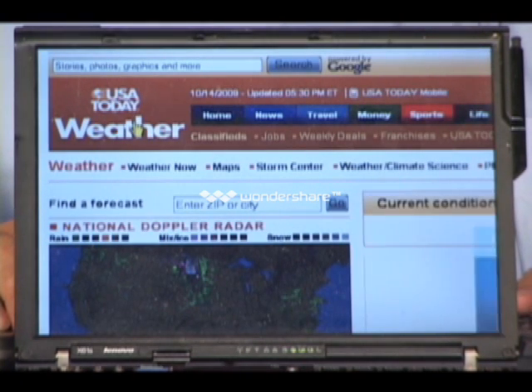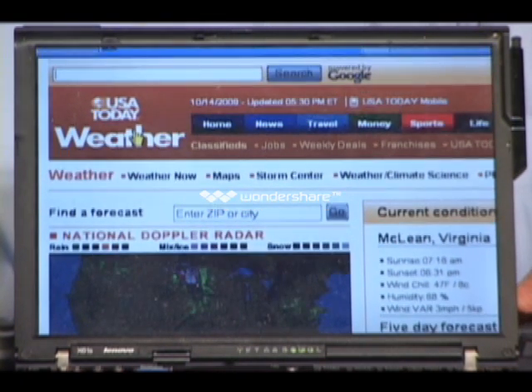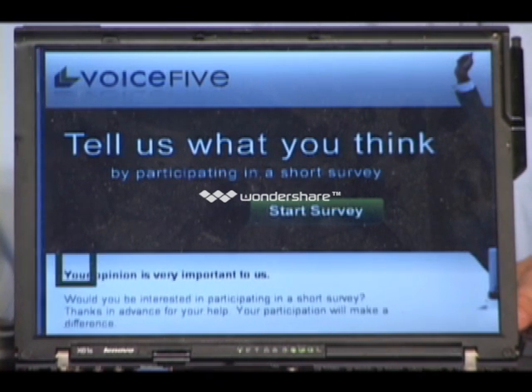part of the page. Now, it is very handy for a totally blind person to be able to have that, but a low vision person also can have that information pulled together on the screen and allow them now to find the link that they want. And sometimes it can be a lot. If you've got 221 links, that's an awful lot of hitting the tab or an awful lot of arrowing around to try to find a link if you can't find it. Okay, this thing is yammering to me. These pages are very busy.